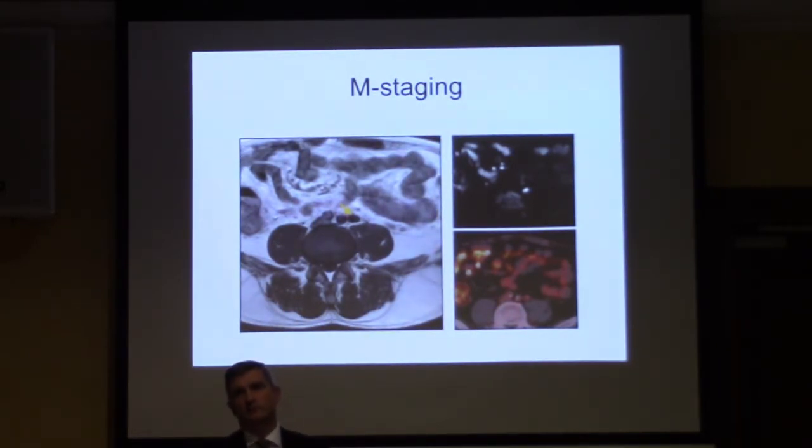All right, so this patient has got metastatic disease. Now, you can discuss that with your surgeon, because they may extend their field and may actually go down and do nodal dissection, but it changes the risk stratification for this patient. So you need to look at where those nodes are.